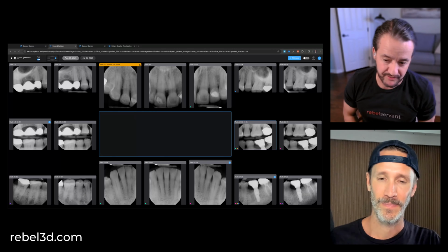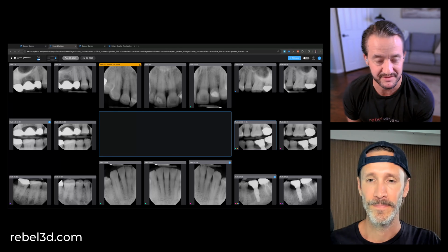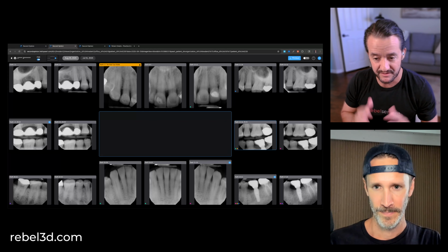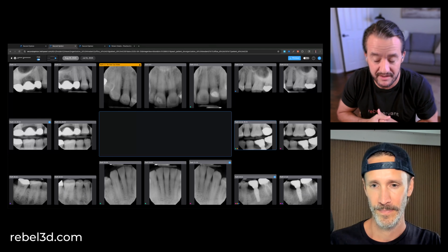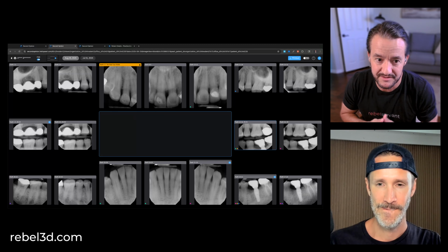So you're a co-founder of Pearl, which is amazing. So I'm assuming you have a heavy hand in the development roadmap and all that kind of stuff. And you're also a user of Pearl. Being a user now for 4 or 5 years of the radiograph software, what would you say you're most proud of? Like, hey, this is what really makes me excited to talk about Pearl with doctors.